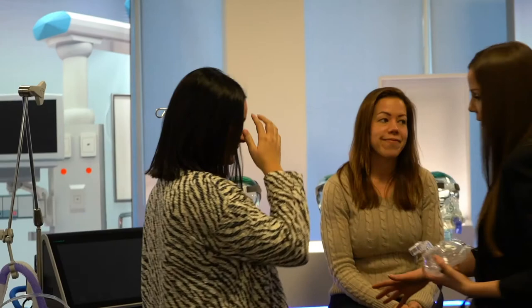So this is our patient, okay? She has a very bad respiratory failure. You can see it in her face. She's struggling to breathe. Those chest walls going in and out, it's tiring her out, okay? So we need to get this on her quick. Okay, so what type of mask do we put on her? It's a good question, but first, what size of mask would be the first thing that we'd need to do? And this is our sizing guide. So this will tell me if a small, medium, or large needs to be used in this patient.